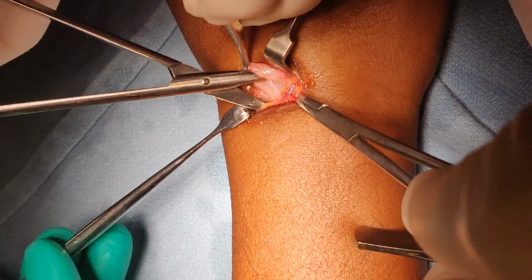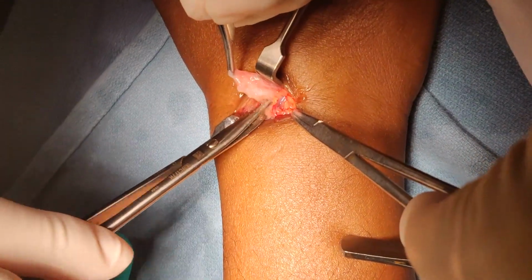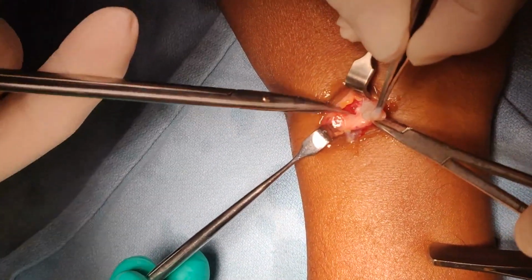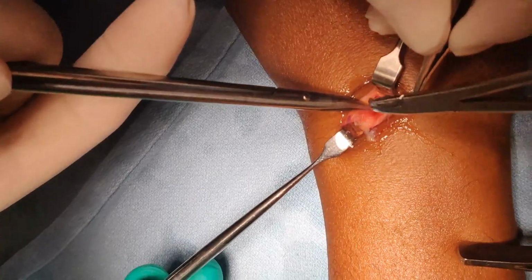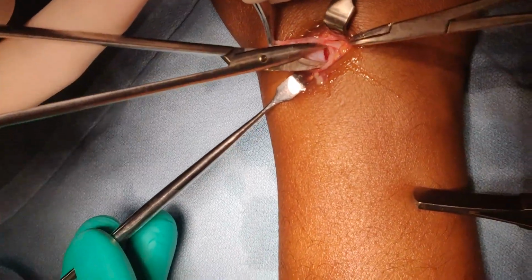As you will see, the ganglion cyst is a thick, sticky, colorless, jelly-like material. Cysts may appear out of the blue and disappear just as swiftly as they came. However, chronic cysts that are prolonged may affect the function of surrounding tendons and the operation of other body parts. Ganglion cysts at the back of the hands may cause a weakness in the finger.